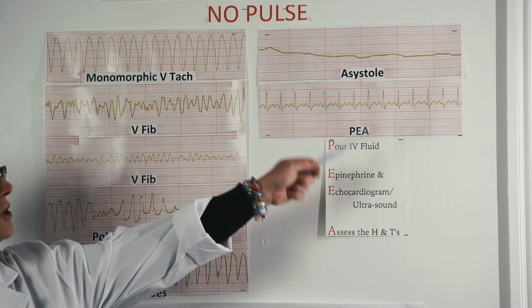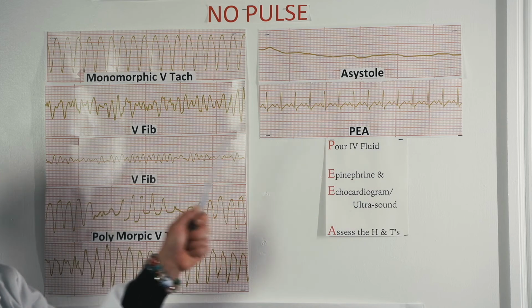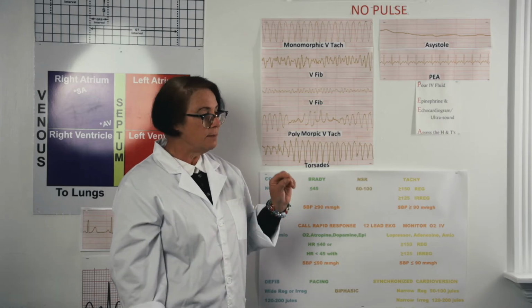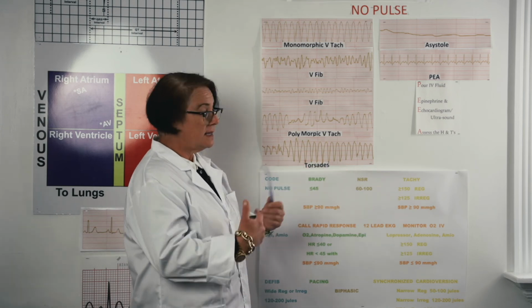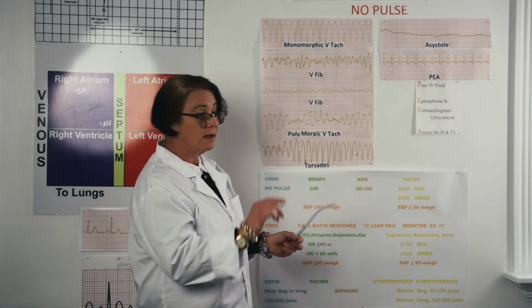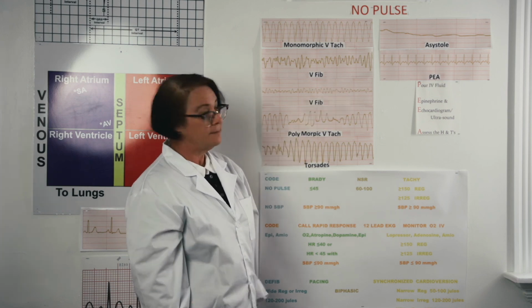But these are not shockable rhythms, and no AED will defibrillate these rhythms. These are your shockable rhythms, the wide ventricular ones, and every AED will self-charge for this. When it comes to defibrillation, some person is going to have to push the button. So realize they'll self-charge, but they won't just defibrillate the patient. Someone is going to have to say clear and push the button in every case. These are shockable, non-shockable. How easy.